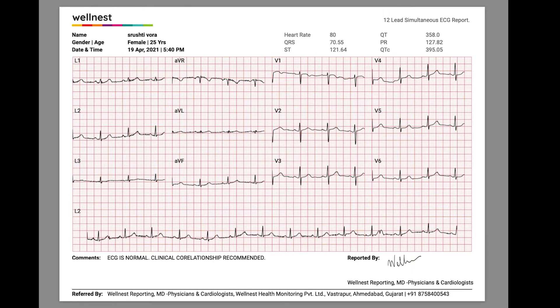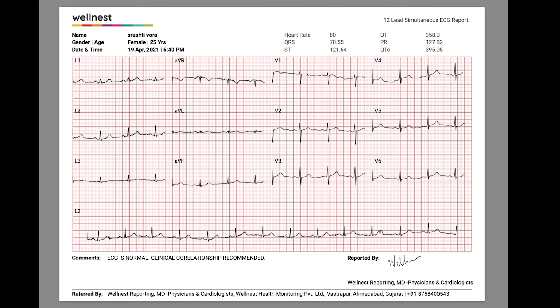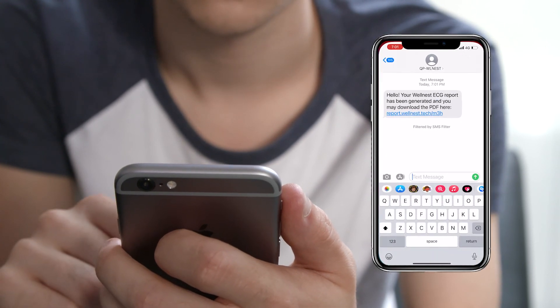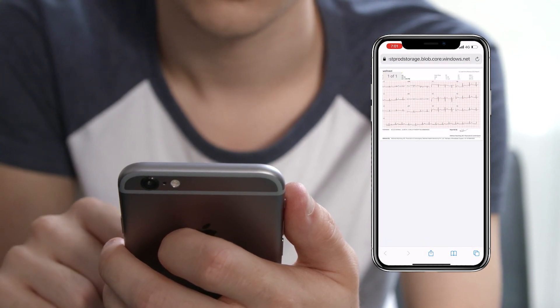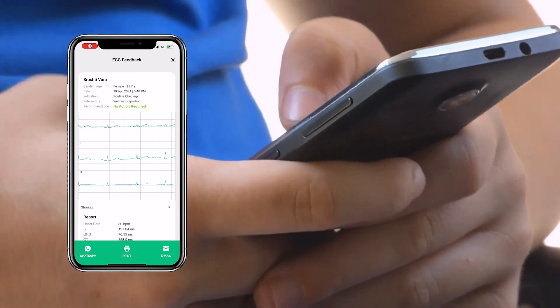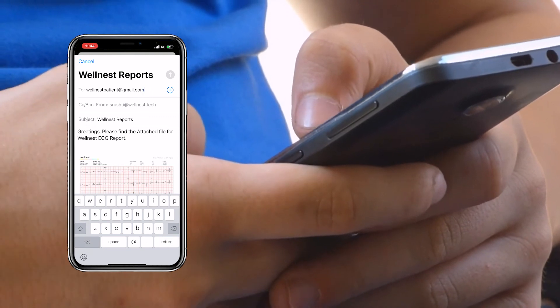Once the ECG report is done, a PDF report is automatically generated with all the relevant information pre-filled, including the patient's, doctor's, and institute's details. Everyone involved in the process is also notified about the report completion. The patient receives an SMS on their registered mobile number with the link to download the PDF report. If required, the staff member may also WhatsApp, email, or print the report directly from their app to share with the patient.